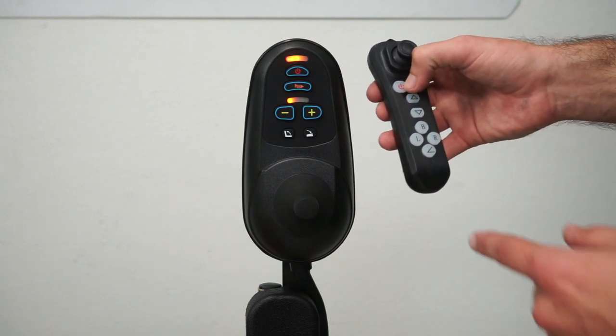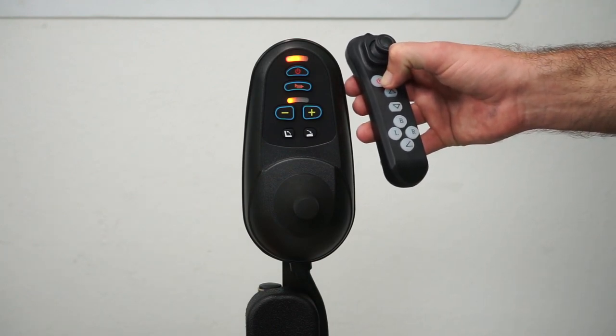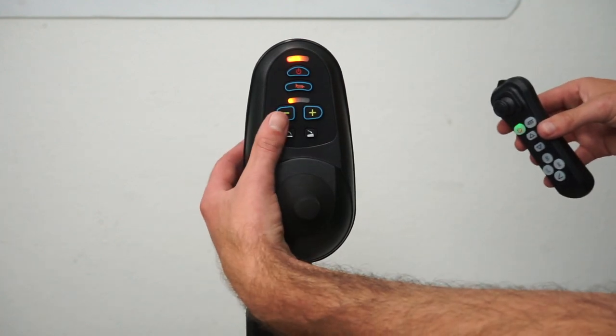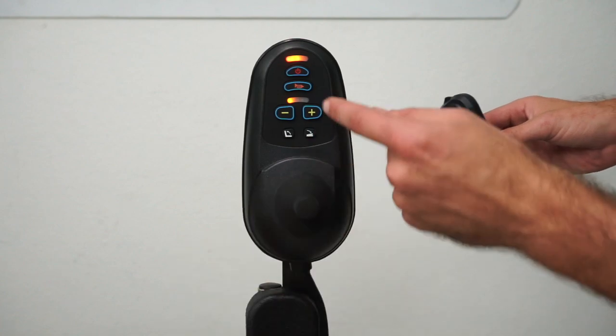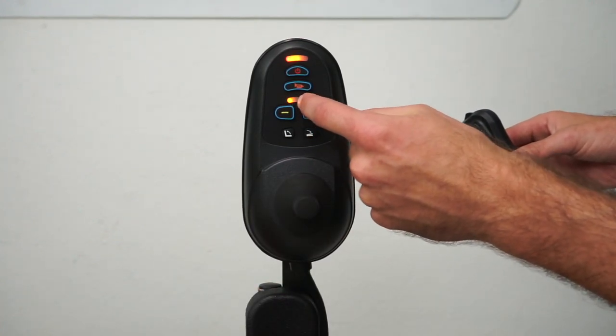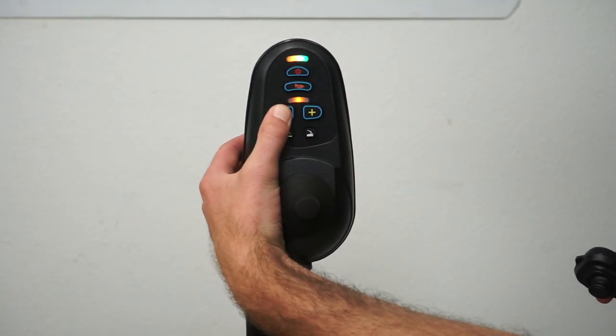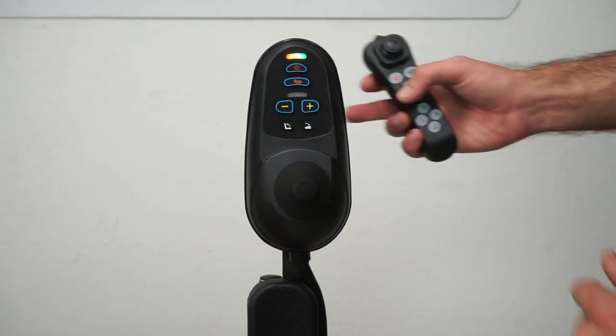Push this button down and it will flash red one time. Now the joystick is on. From here, hold down the speed decrease button until a single amber light appears in the center of the speedometer. Then press the horn button.